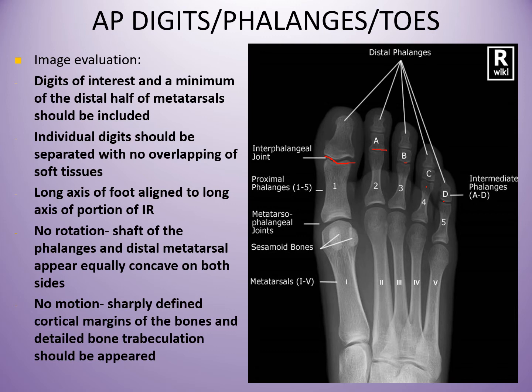when you are, contohnya kita nak project the second toe ni. Kan. So at this you include part of the big toe as well. Kan. Enough to include this. Cukup lah.